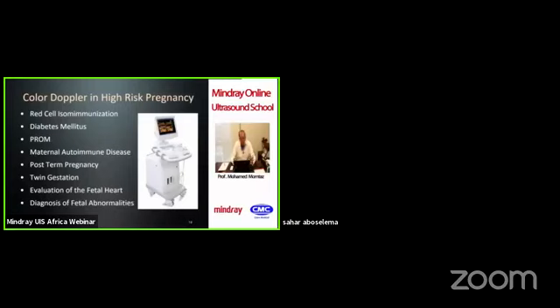Actually, everything is automated. You put the box on the vessel, you press color, you will have the vessel, you put the pulse wave cursors on the vessel, you just adjust the size of the box and the angle, and then you press auto measurement, you will get the flow measurement. What you need to do is to understand the value of doing this Doppler. When to do it?